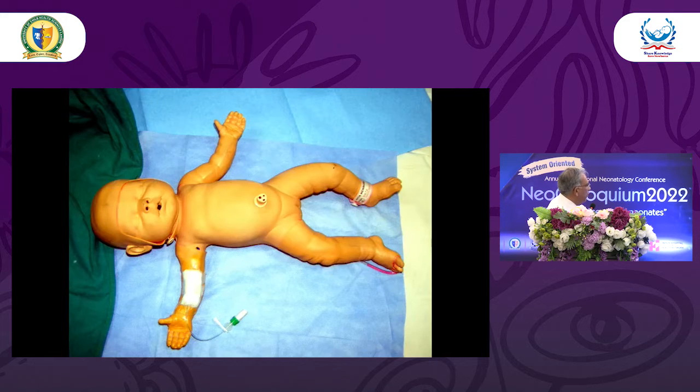This is how it finally looks. Look, this is that sterile dressing, and all of it is totally sealed. This is a needleless connector at the end of a long line. A needleless connector makes it easy to attach and detach different fluids to the long line.